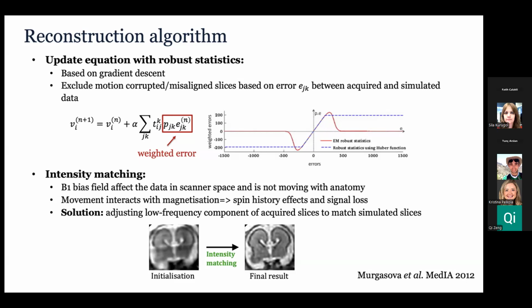Yeah, I think so. And how about the low field? Do you see this artifact in the low field as well? Well, again, it depends on how well you do your shimming. Yes, there can be quite strong ones. But low field is Siemens again, so same thing. Theoretically it should be less, but then again, you need to shim. But in general, you find the low field better than the high field.